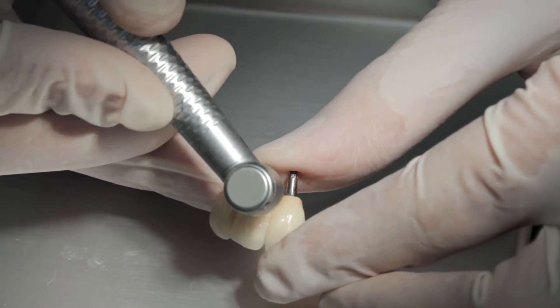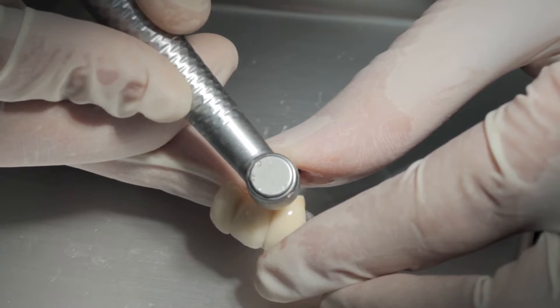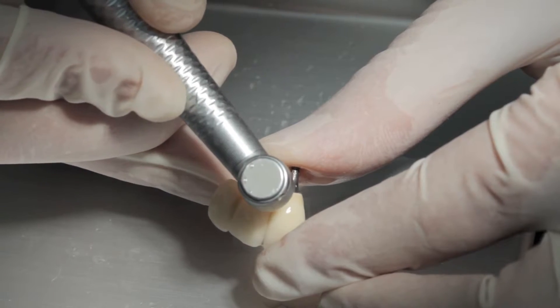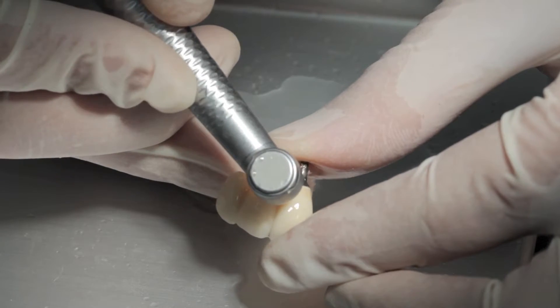We normally need to give these a bit of a wriggle to get them off — that's it, all done. So we need to open up the embrasure space between the two implants to allow safe and easy passage of the teepee brushes.